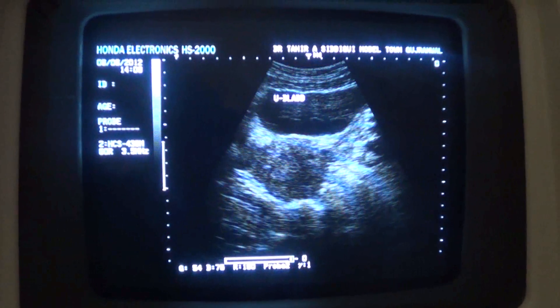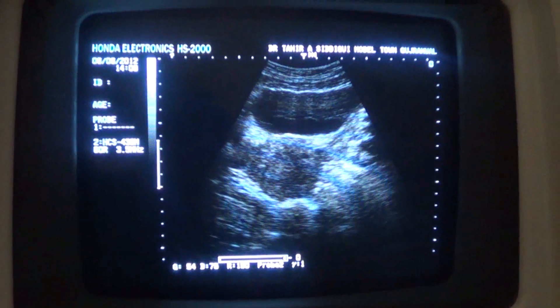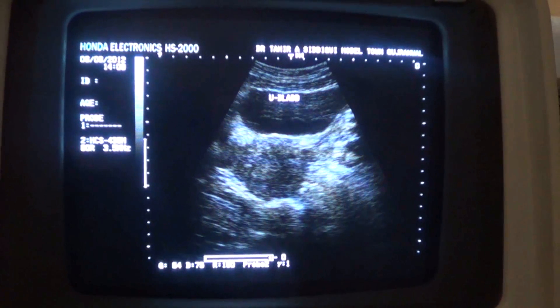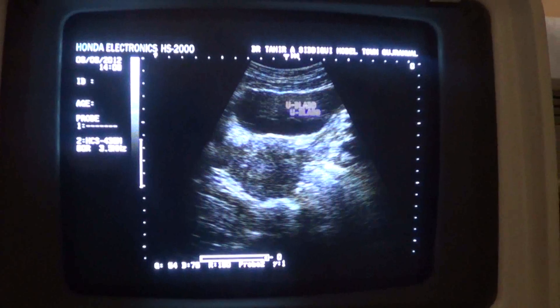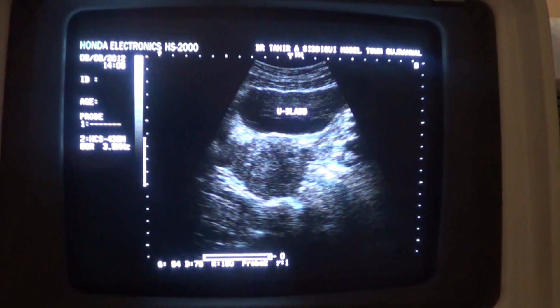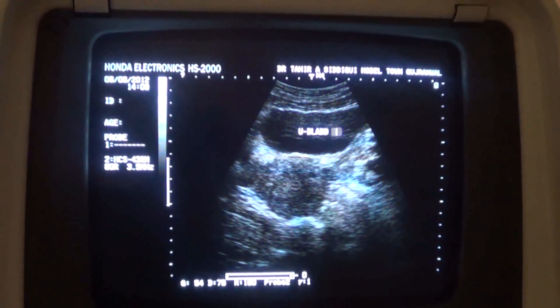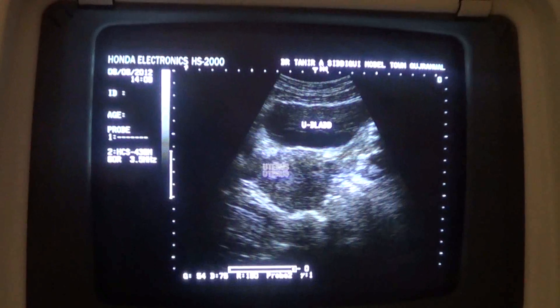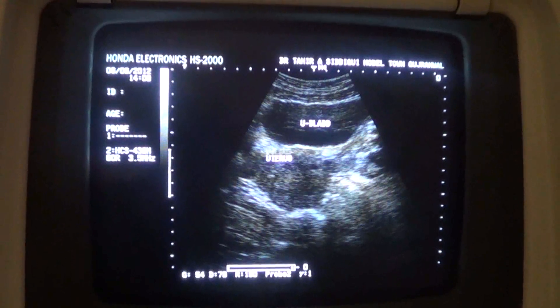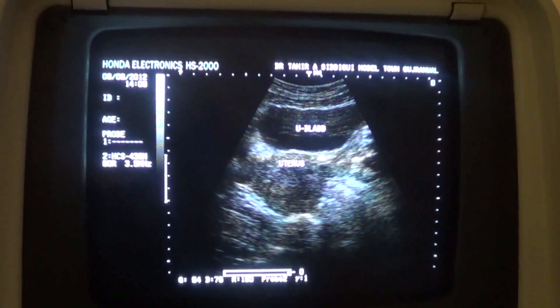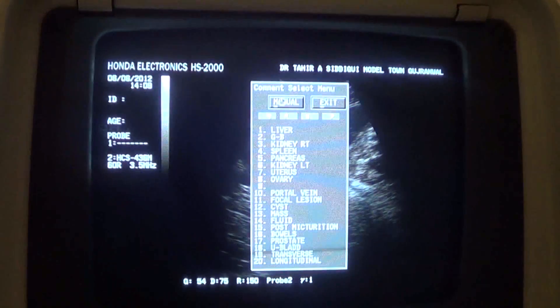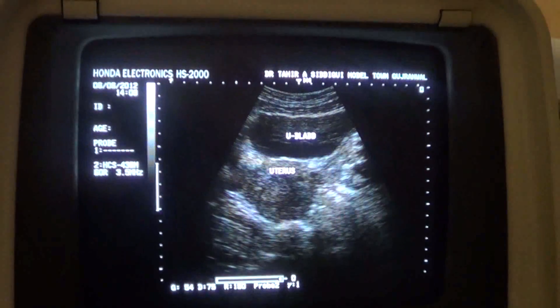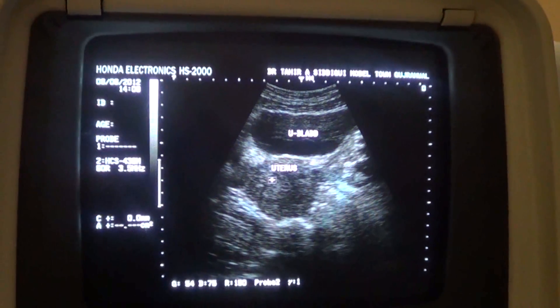This is the transverse section of the female pelvis, aged 40 years. This is the urinary bladder in transverse section, and this is the uterus in transverse section, with this being the endometrial canal in this area.